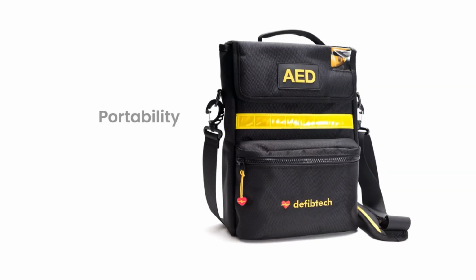Finally, we might want the AED to be more portable. If that's the case, you can purchase a soft carry case. When an AED is portable, whether it's on the sidelines, during a practice, or a game, make sure it is always visible and someone can grab it quickly when it is needed.